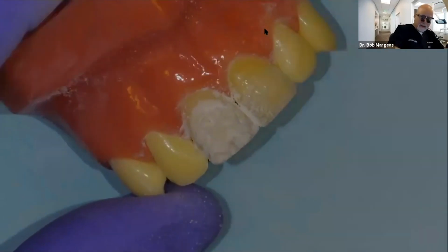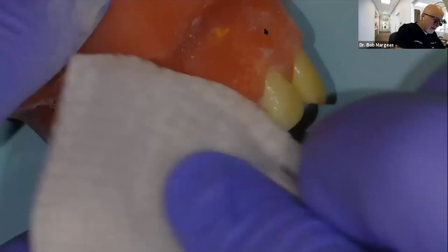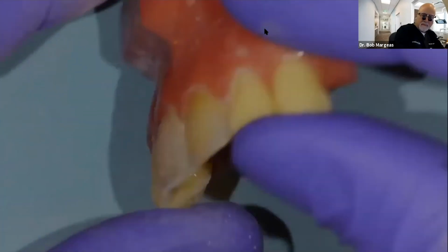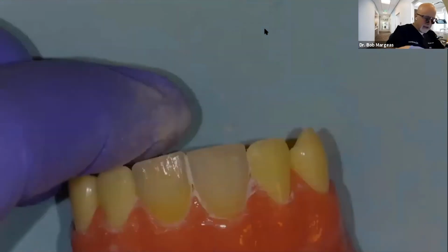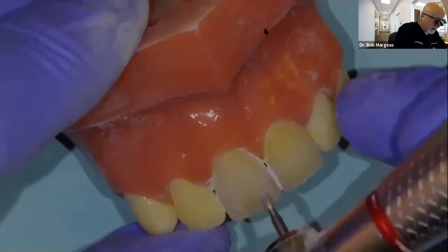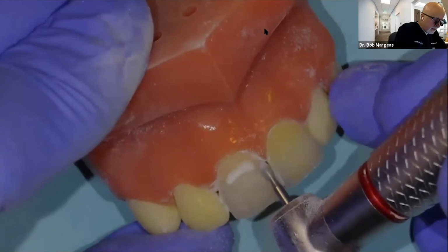Okay, like that, with the powder and everything. And then you'll start to see the tooth take shape. All right. Now, once I have that, what I want to do is do some imbrication lines across the tooth like this. I'll take this burr here and I'll draw this like this. There's usually 3.